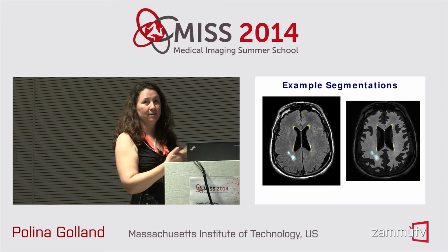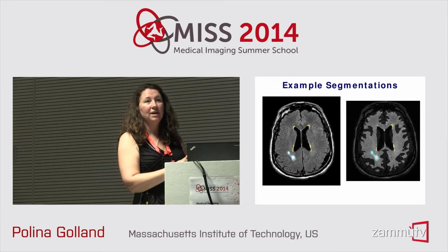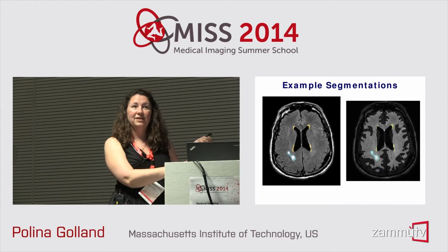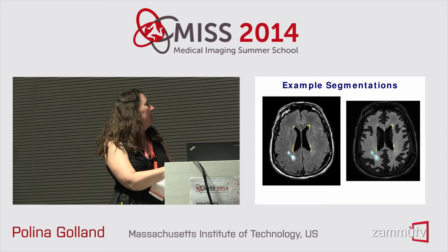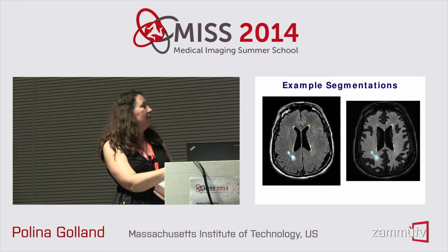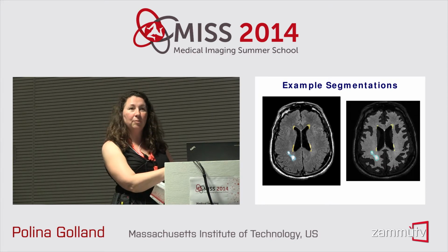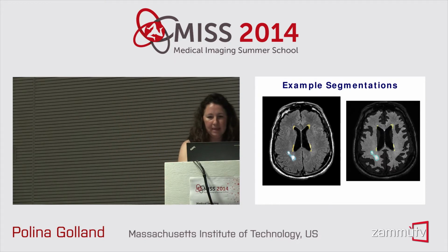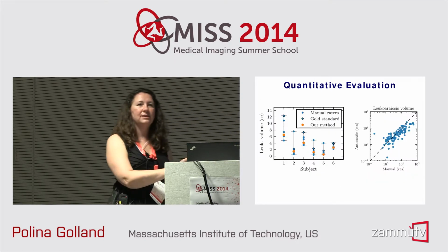Now, what you can't see is the contrast here, but I want you to compare these two. Our healthy segmentation of the tissue is quite off in the area of the ventricles here, right? So look at the ventricles. This segmentation should go like that. For this particular subject, it had no effect on segmentation of the leukoaraiosis, because this subject happened to have no leukoaraiosis in these areas. If there were, it would be a problem, because we would completely miss that part as somewhere you should even look.